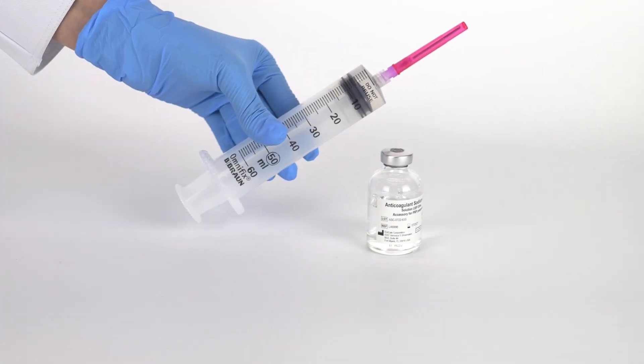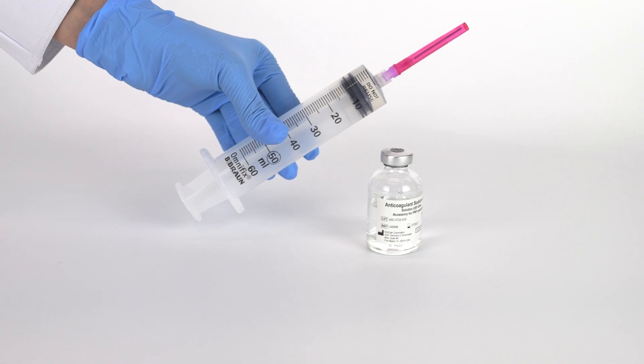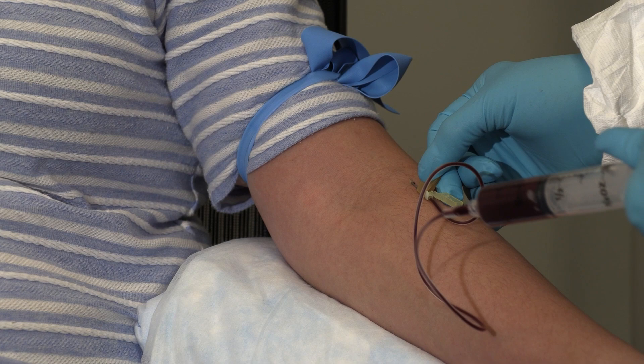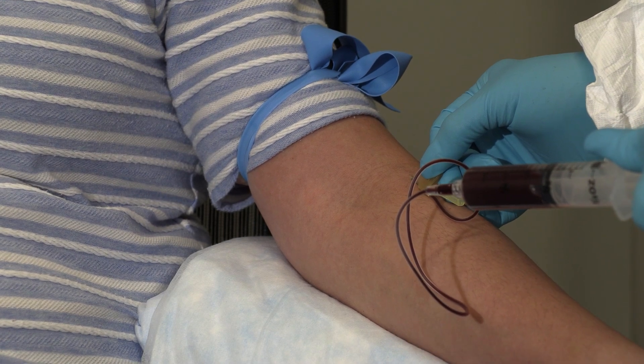Fill a 60 milliliter sterile syringe with 6 milliliters of citrate anticoagulant. Then draw 54 milliliters of blood from the patient, filling the syringe to 60 milliliters.